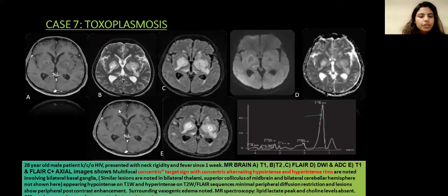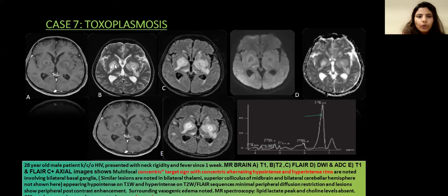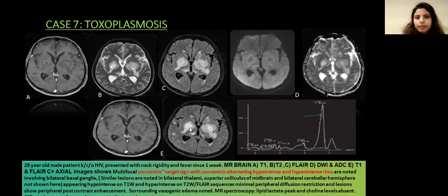Next case: 28-year-old male, known case of HIV, presented with neck rigidity and fever since one week. MR brain T1, T2, FLAIR, diffusion-weighted, T1 and FLAIR post-contrast images showing multifocal concentric target sign with alternating hyper- and hypointensities involving bilateral basal ganglia, appearing hypointense on T1, hyperintense on T2 and FLAIR, showing minimal peripheral diffusion restriction and post-contrast enhancement. On MR spectroscopy, there is a lipid lactate peak while choline levels are absent. CSF cytology confirmed toxoplasmosis.